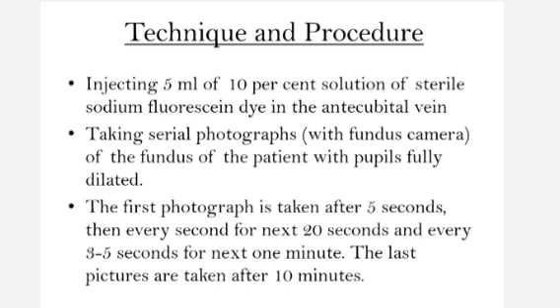So friends, before starting this test, both eyes of the patient must be fully dilated, it is compulsory, and the first photograph is taken after 5 seconds, exactly. Then every second for the next 20 seconds, and every 3 to 5 seconds for the next 1 minute, and the last pictures are taken after 10 minutes.